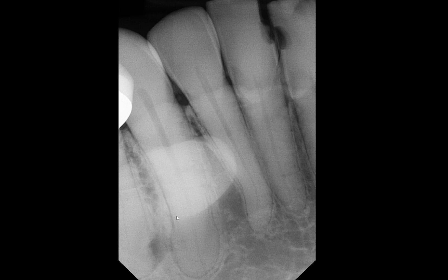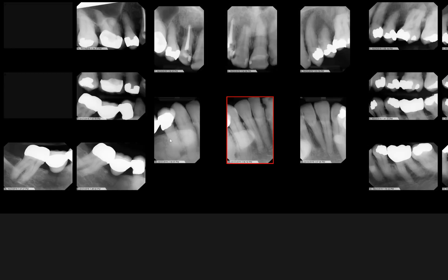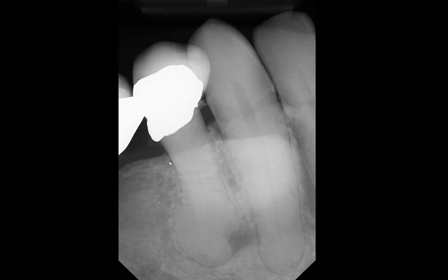Another thing you may have noticed is there is a relatively well-defined radio opacity in this area. This is consistent with mandibular torus. On the next radiograph, you can still make out the outlines of the mandibular torus, especially at the mesial aspect, though its posterior border is a little more difficult to see.